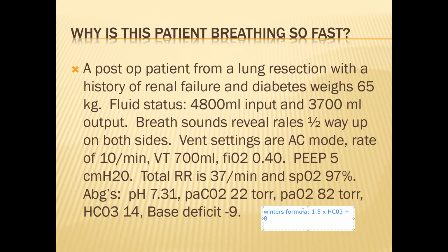The patient is causing the CO2 of 22. Good point. I can never follow what to do when he says, what is Winter's formula? You come up with a number, and then what do you do with that number? But this patient's breathing 37 times a minute. So putting 29 into the formula to figure out the respiratory rate for the ventilator wouldn't help, would it?